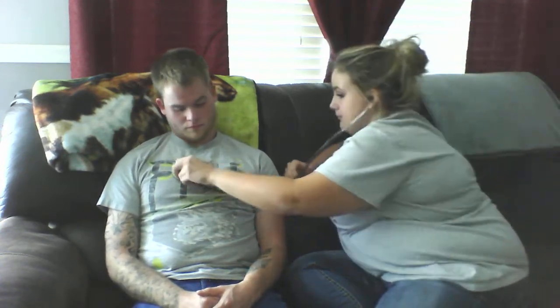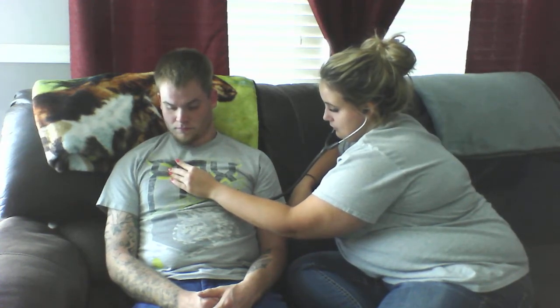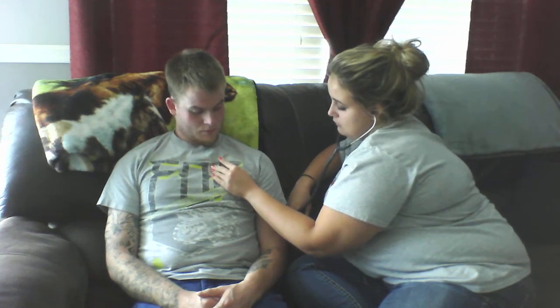Then I can go ahead and auscultate my apical pulse for a minute. And we'll pretend we listen for a minute, and that's how you would auscultate the apical pulse. I can go ahead and also, I'm going to listen to the different points of the heart. So we're going to start with the apical, or the aortic, I'm sorry, the aortic. Pulmonic. Erb's point. Tricuspid. And mitral. And with that, I don't hear any abnormalities either, which is a good finding.